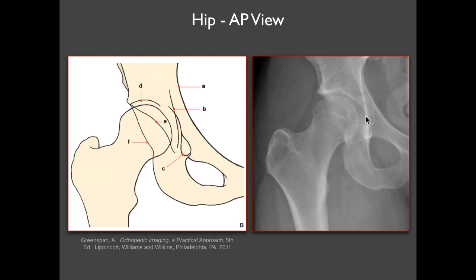Centrally, you have the acetabular fossa. As I mentioned in the beginning, there's actually no cartilage there — it's filled with fat and a ligament that we'll look at a little bit later.